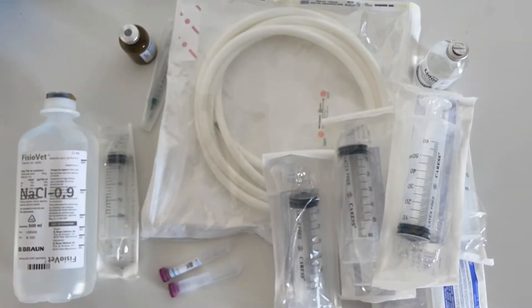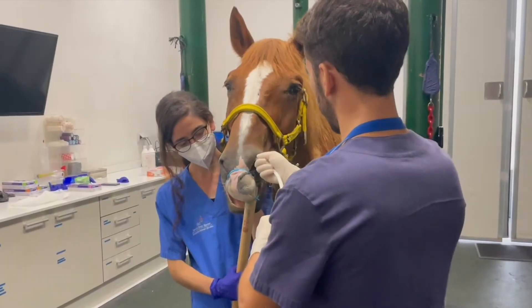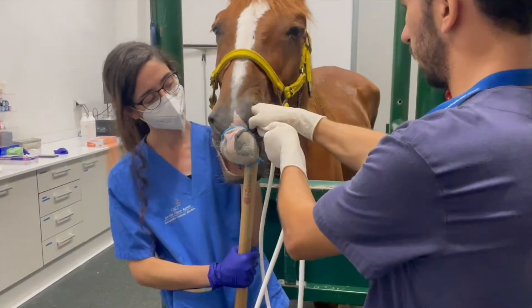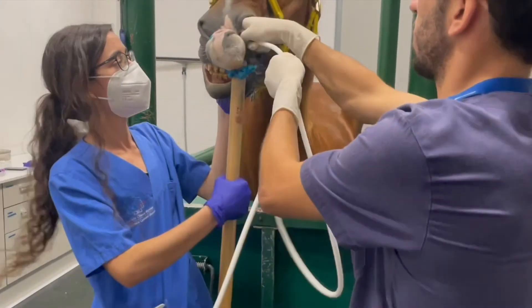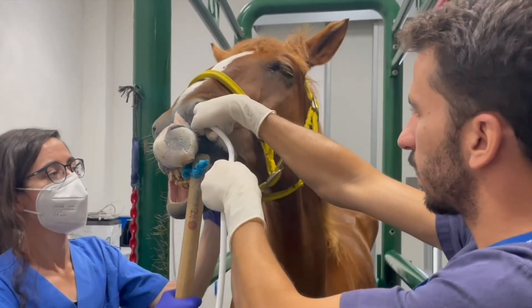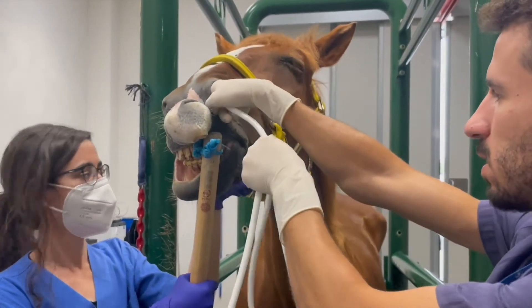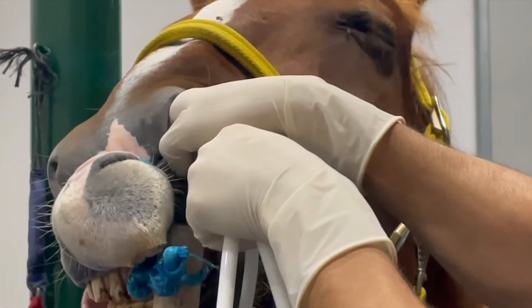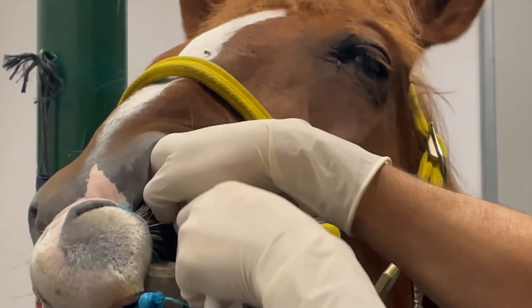Now let's see how to do it. After the patient is adequately sedated, additional restraining with a nose twitch can be used. Three people are usually required to perform this procedure: one restraining the patient, as Barbara in this video; another passing the lavage catheter, and here we have Adri.